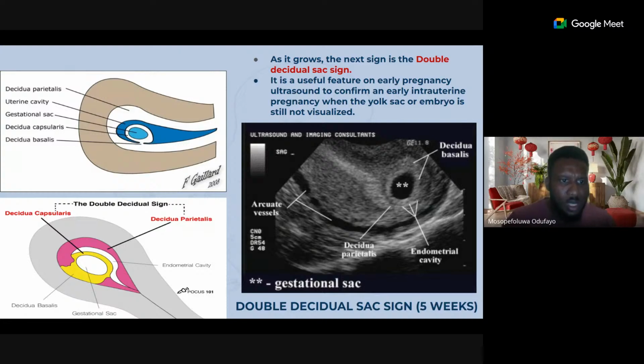It's very simple. If you look at this image at the bottom, just try to use your imagination. Remember that picture I showed you. When the blastocyst wants to implant, it will bury itself in the lining of the endometrium. It's not that it's going to stay inside the cavity. So here in this diagram below, where I'm outlining in green, you can appreciate the cavity. The cavity is present. The embryo doesn't just stay suspended in the cavity. What happens is it digs a hole in the endometrium.